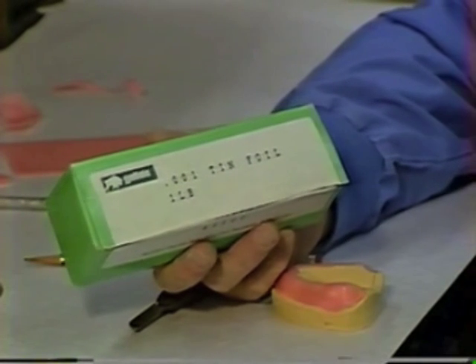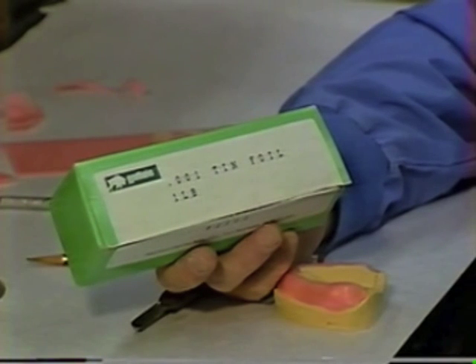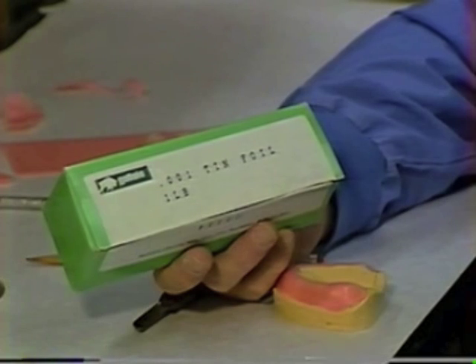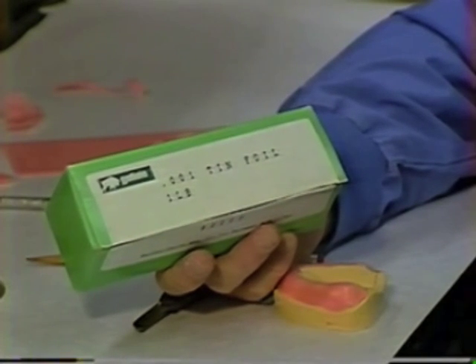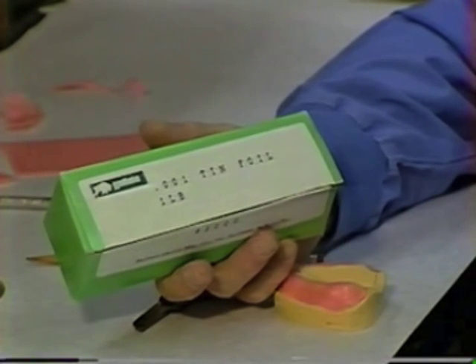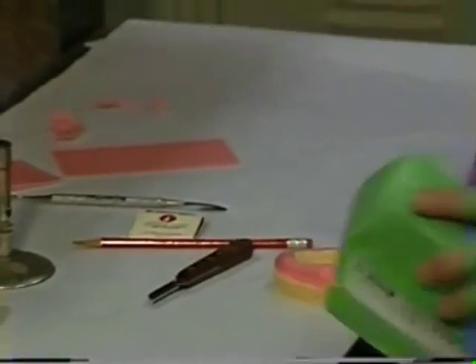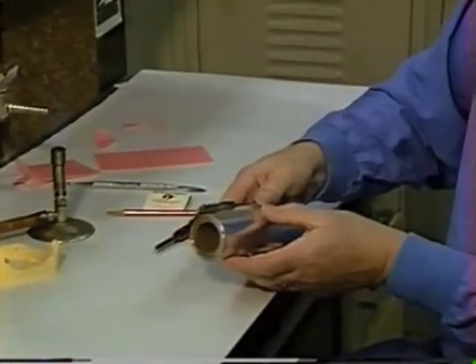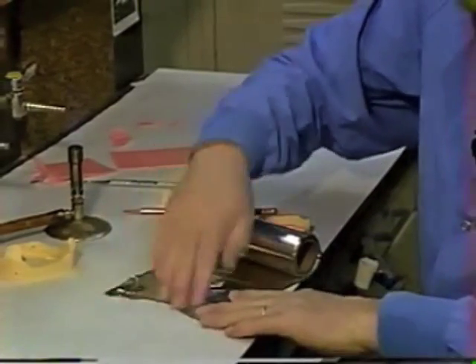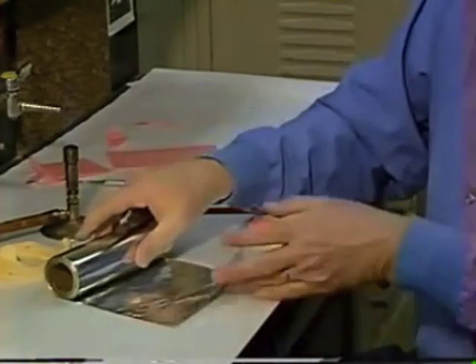And I know the question always comes up, why do you use tin foil rather than something real cheap like aluminum foil? Tin foil can be burnished onto the cast and get nice and smooth. If you use aluminum foil, what you usually end up with is a very wrinkled surface and a very unaesthetic tray that really does not work very well. Tin foil comes to us in 1-pound packages from the manufacturer, and we're just going to cut some little strips of the tin foil off. We don't need much of this, just a piece about like so.